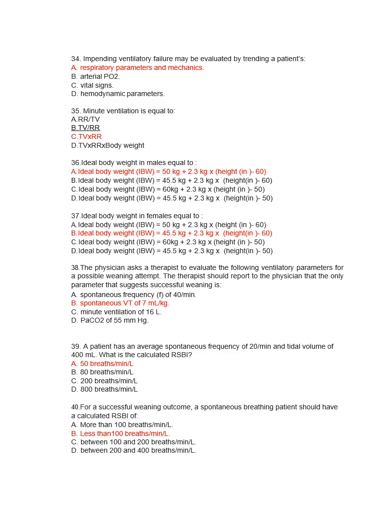But if the patient's frequency is 40 per minute, the patient is tachypneic. If the minute ventilation is 16 liters, maybe because of the increased frequency, the patient will be having increased ventilation. And PaCO2 of 55 means the patient is not adequately ventilating. There is some carbon dioxide buildup. So these are the ventilation criteria, or the weaning criteria, for weaning a patient from the ventilator. So basically, if the patient's spontaneous tidal volume is 7 ml per kg, we can wean the patient from the ventilator.